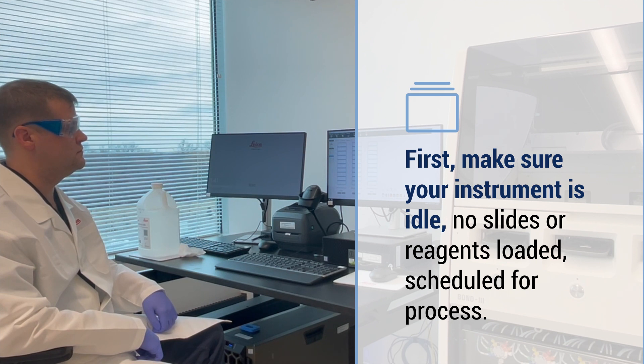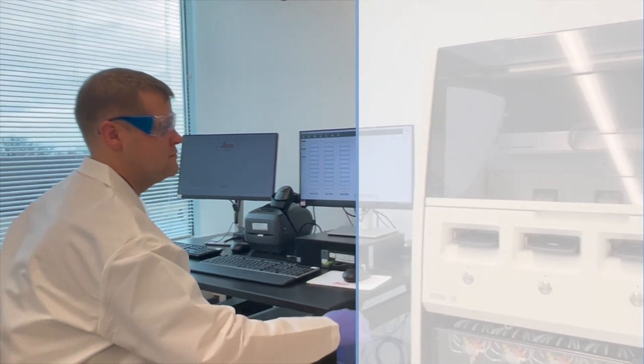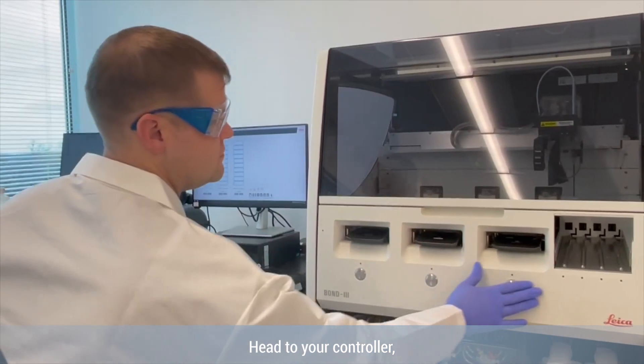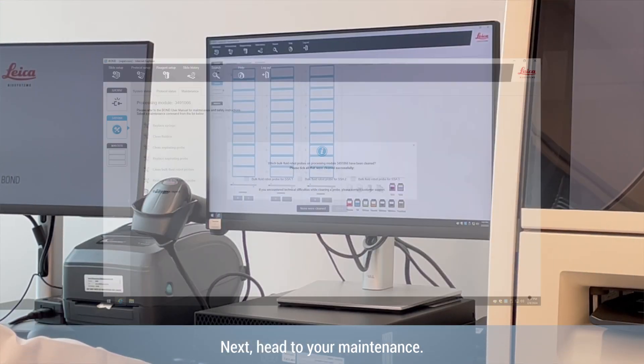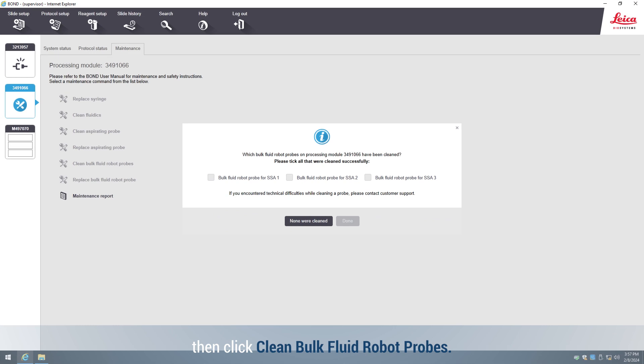No slides or reagents loaded, scheduled, or processed. Head to your controller, go to your system status screen on the instrument tab, and select the instrument you'd like to clean. Next, head to your maintenance, then click 'Clean Bulk Fluid Robot Probe.'